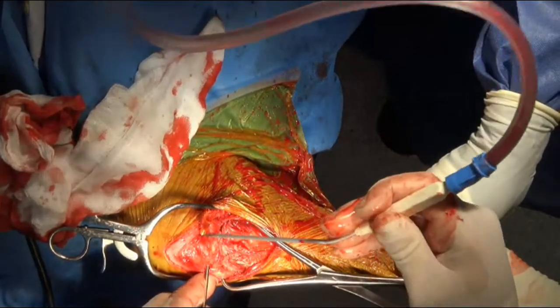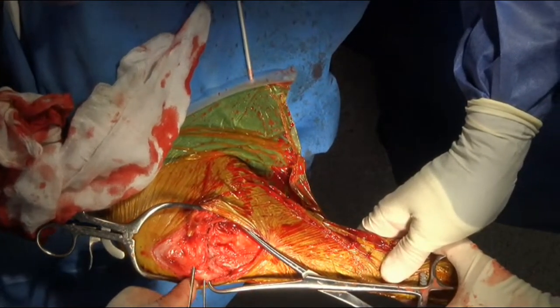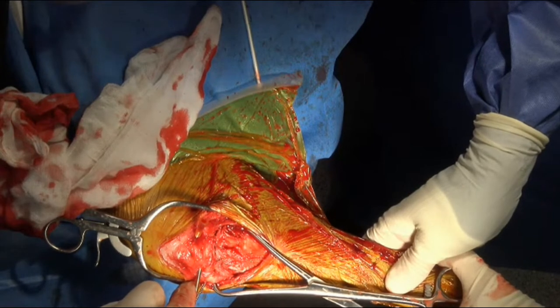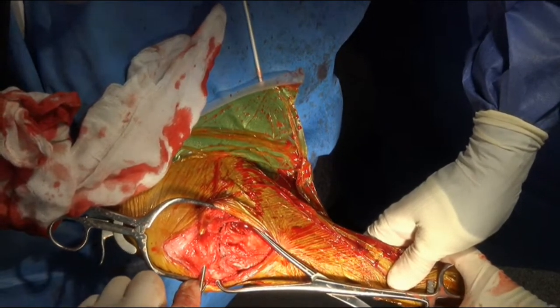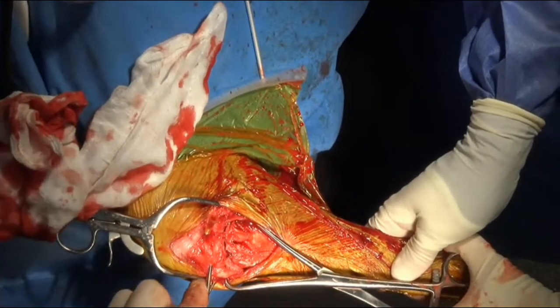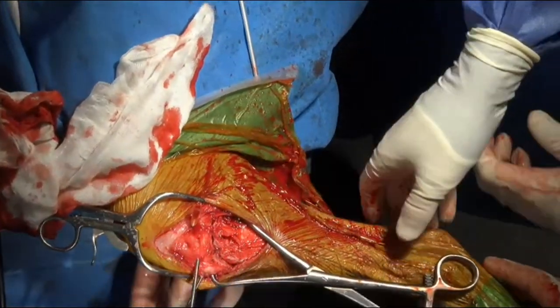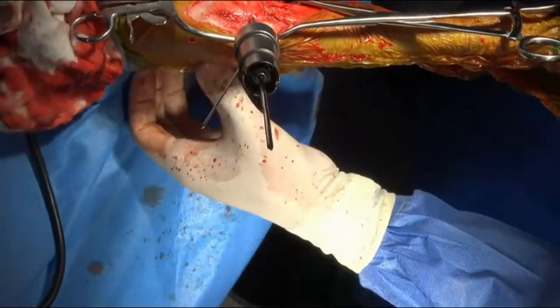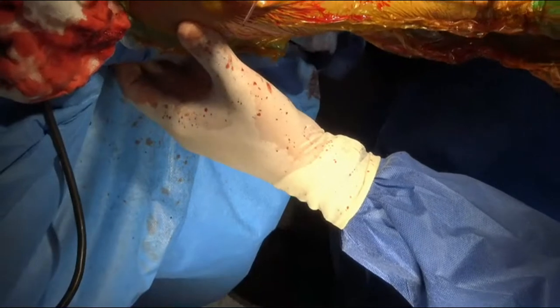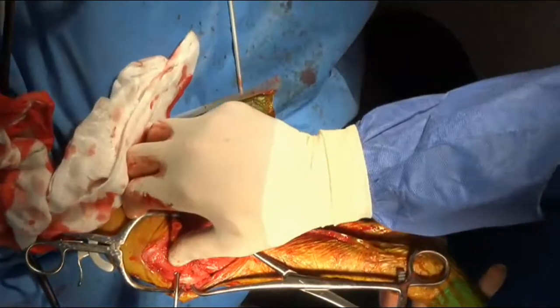So I'm just making sure I get everything lined up here. I'm just going to get my first 062 pin across here. Before I get too excited. Just when I get this in, I'll talk to you a bit more about what I'm doing. So you can reach. We grab another 062. Just relax on that a bit, and that should be relatively solid. So I'm just going to make sure the leg's on straight. That's the first thing we want to do here. So I'm just running the leg through a range of motion and eyeballing it. I think that looks pretty good. Let's hold on to that again, Yui.